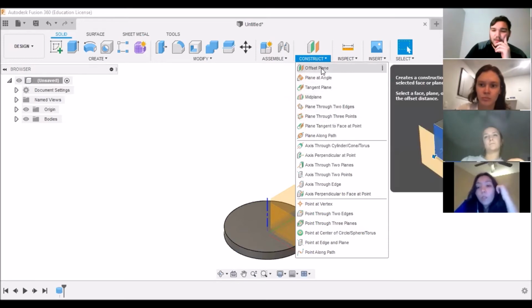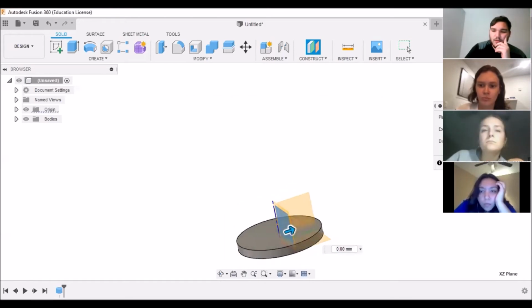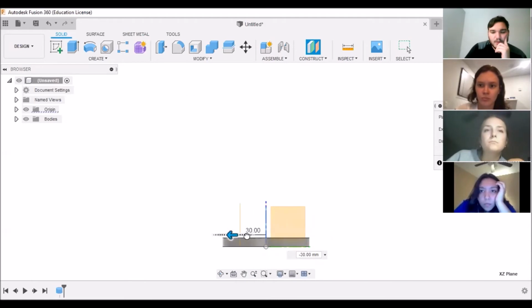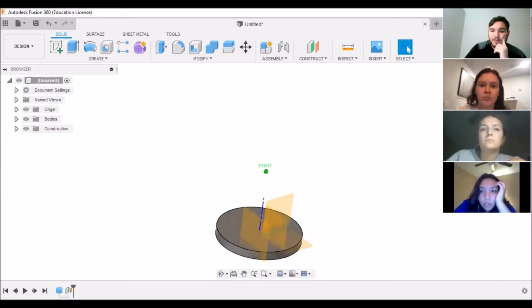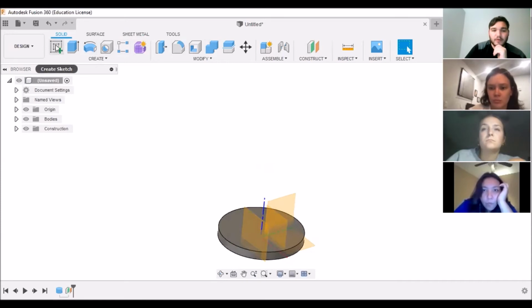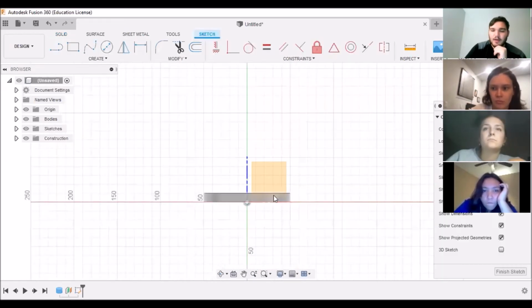So we can do an offset plane of one of the vertical planes. And let's just do it about 30 out. Okay. And so now we have 2 different planes that we can pick from that are parallel to one another. So if we wanted to sketch, we can click Create Sketch up at the top, select the new plane that we just made, and it looks 2D and sketches exactly where that is in 3D space.